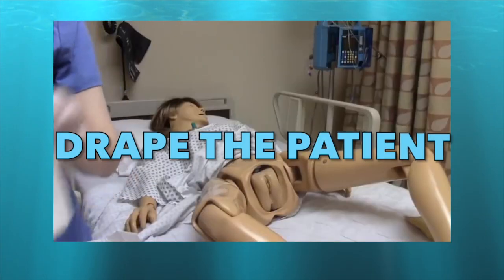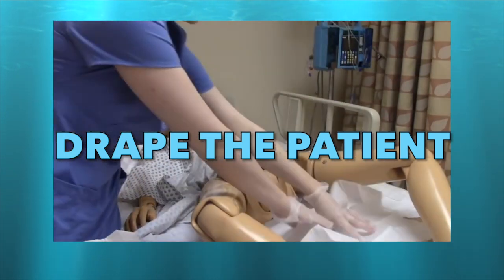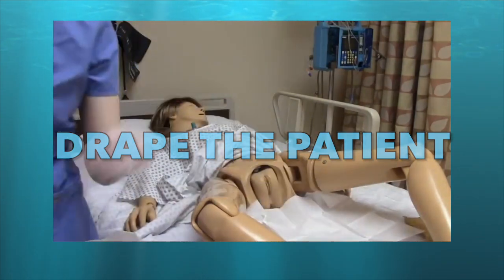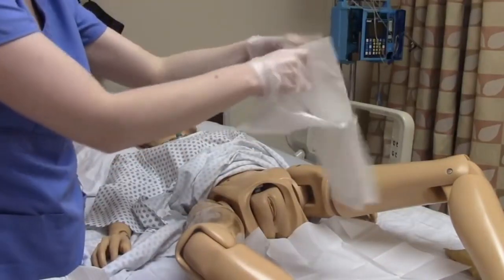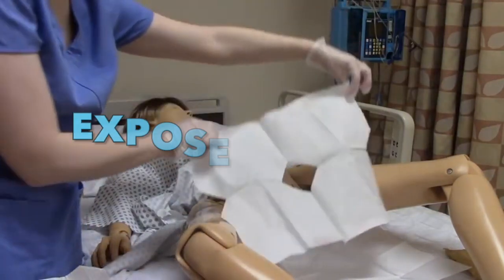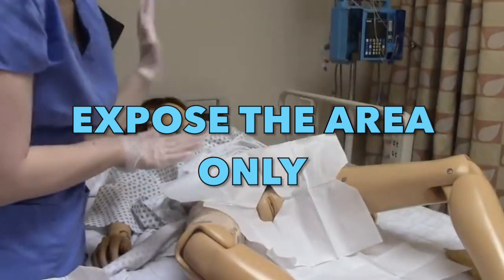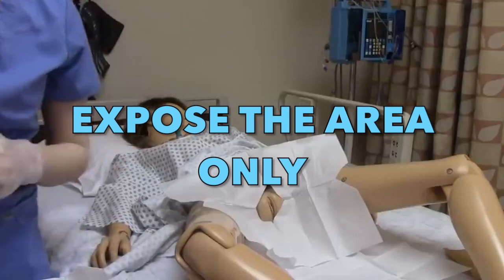We are already prepared for the insertion. Place the plain drape under the patient's buttocks, as we will use it to hold our materials. Then place the fenestrated drape over the patient to cover everything except the area we need — expose only the area required for insertion.